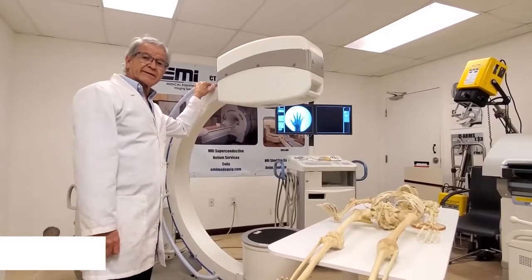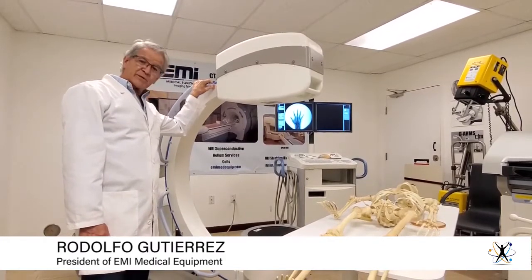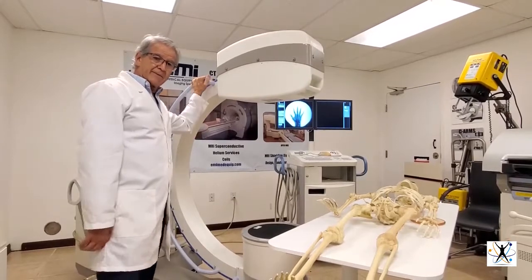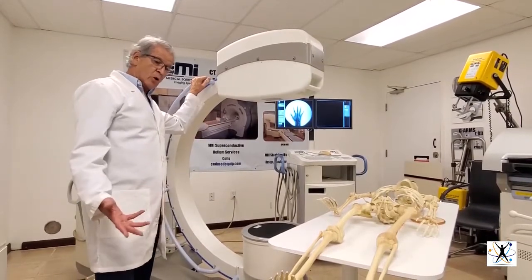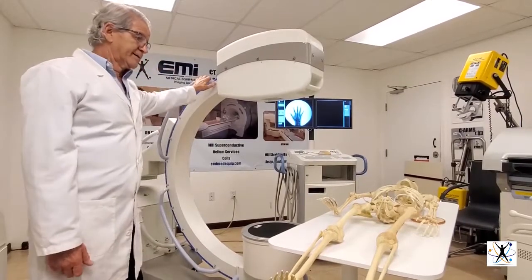I'm Rodolfo Gutierrez, President of ME America. I want to present this C-Arm and show the benefits that we can obtain.